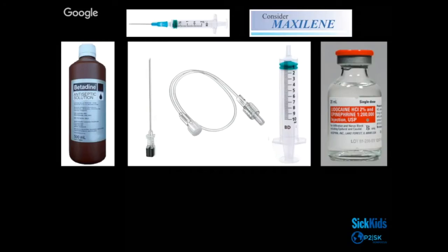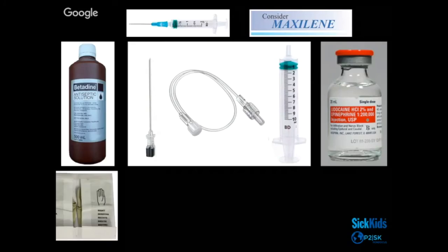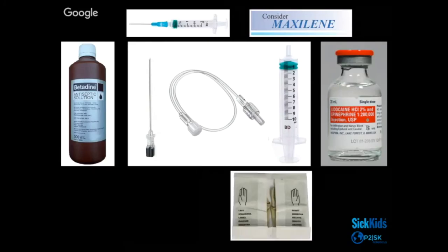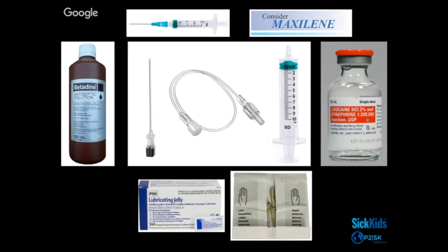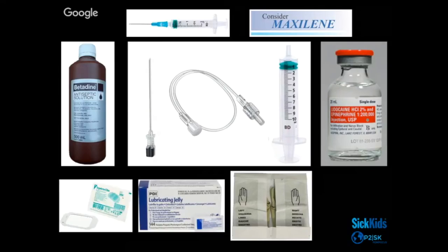Prep the patient, so clean the area with either betadine or chlorhexidine or whatever you have. You want to be sterile, though it's not a perfect sterile procedure. If it's not completely 100% sterile, it's okay, but still you want to try to be as sterile as possible. So sterile gloves on, sterile gel as well, and then something just to protect your probe. So you put the Tegaderm on top of the probe so that the Tegaderm is sterile on the probe that is touching the patient. And do not forget the little band-aid that you're going to need when you are done, because it usually bleeds a little bit. So just have a band-aid with you.